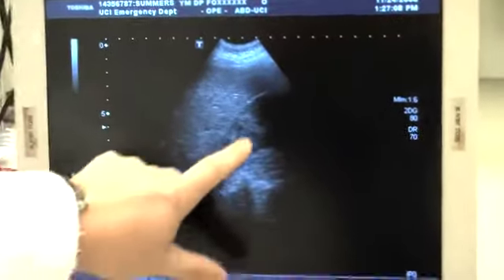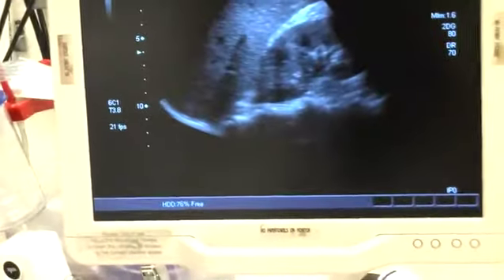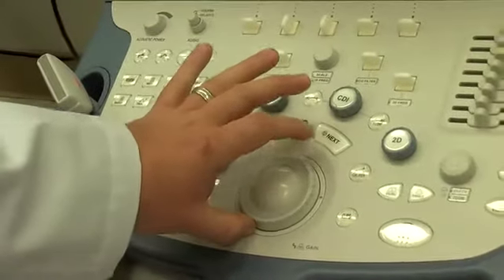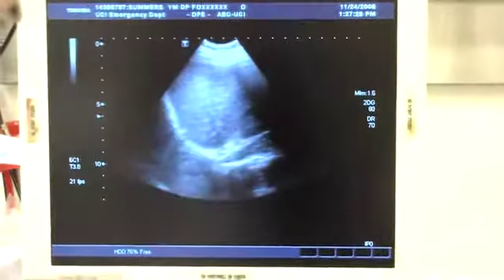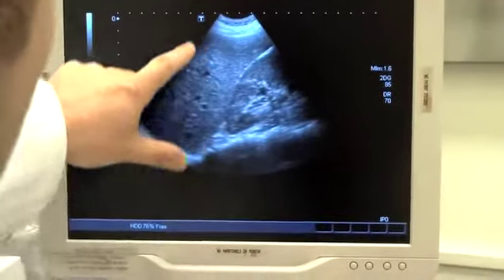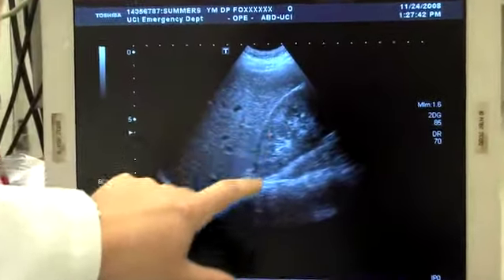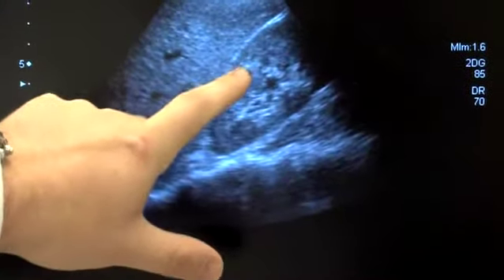A couple things you can adjust while you're acquiring your images. This right here is the gain function. This is the amplification of sound energy. So if you turn it way down, it's going to make the screen uniformly dark. If you turn it way up, the screen is going to be uniformly bright. The right amount of gain would be somewhere between where the liver parenchyma has a slightly increased echogenicity compared to the renal cortex. So you can see how the renal cortex right here is a little bit less bright, or less echogenic, as we would say, than the liver parenchyma. So this is probably the optimal gain setting right about there.